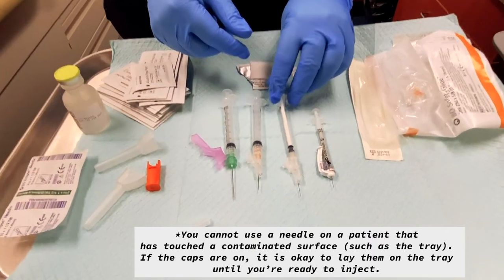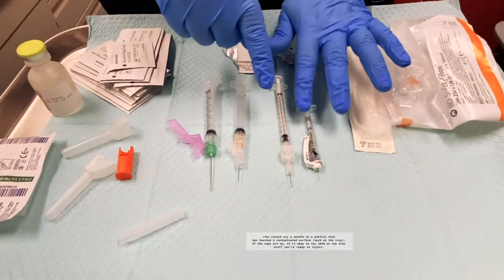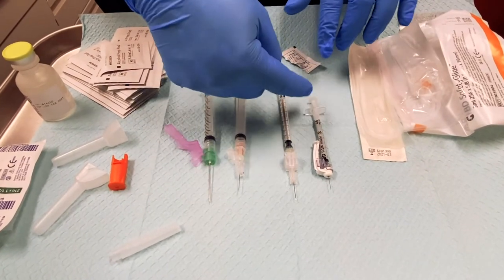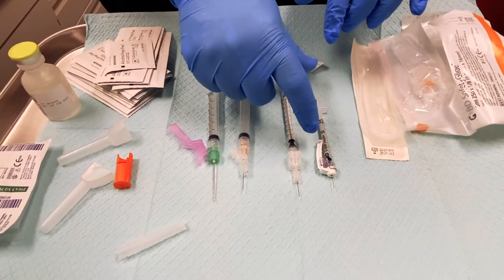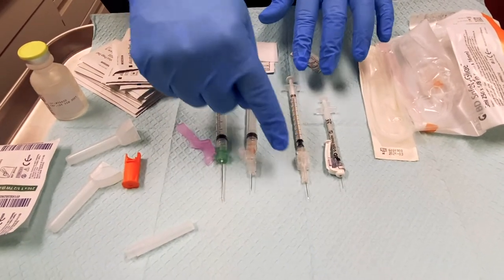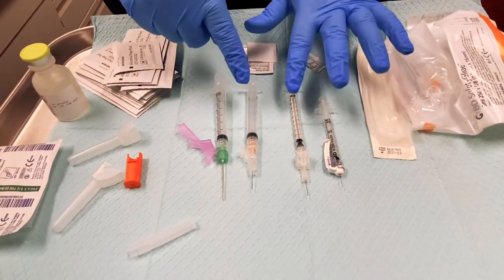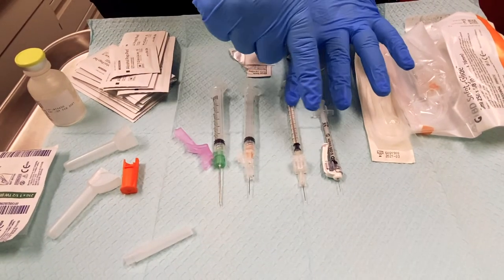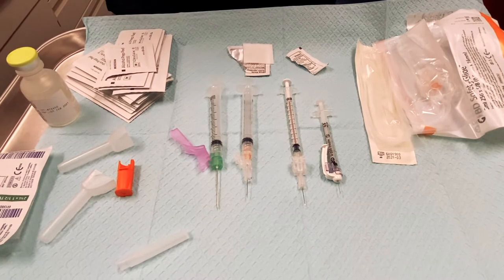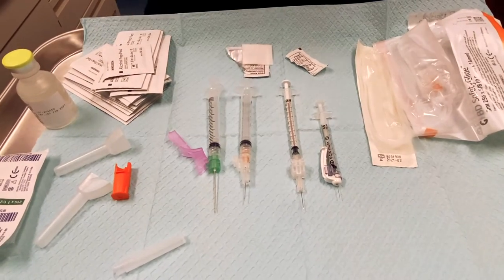From smallest to biggest: we have insulin, which is a 29 gauge — very thin — and these particular insulin syringes are only 50 units or half a mil capacity. We have our tuberculin syringes, which are 27 gauge; this particular needle is 5/8 inch long. This is used for TB injections.